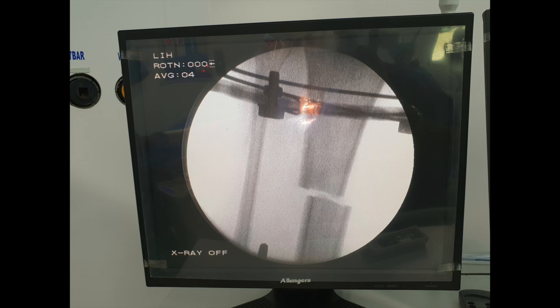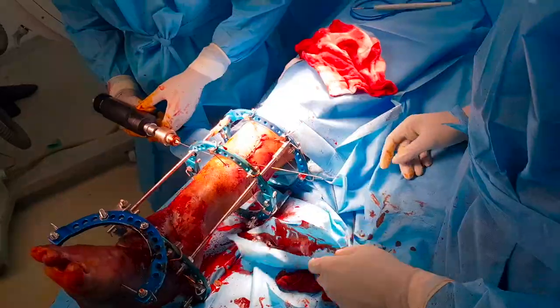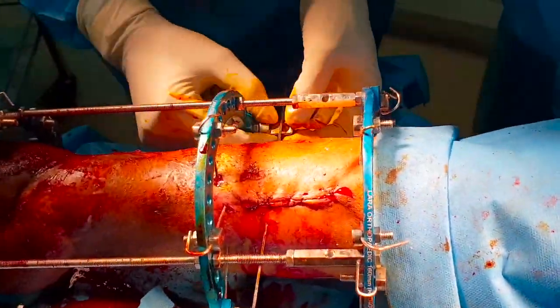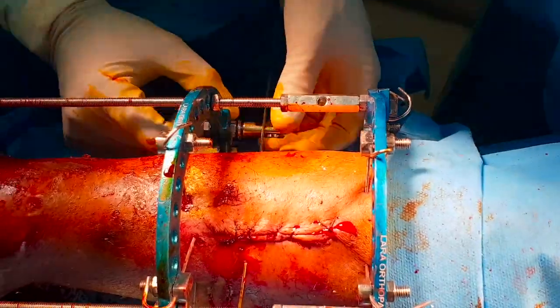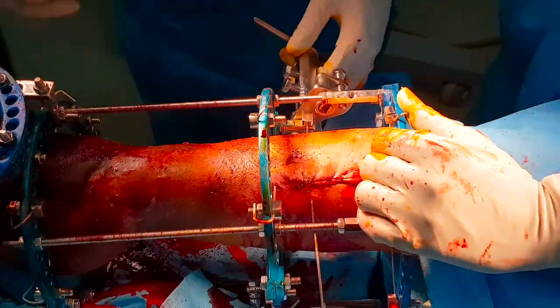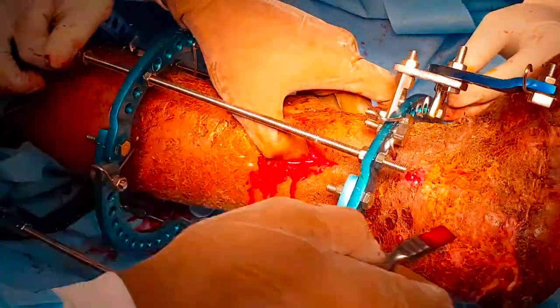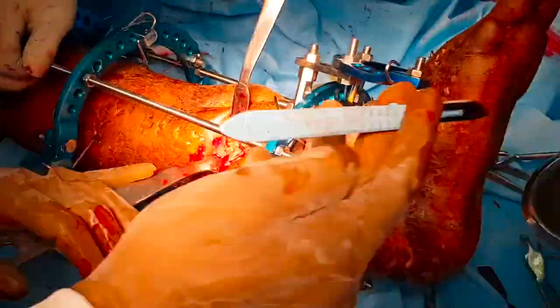After crossing one cortex, the olive wire is pulled from the other side and attached to a post wire fixation bolt assembly. Using a manual tensioner, we now tighten the wire, which makes the olive pull the displaced fragment more centrally to a position of acceptable bone transport and encouraging regenerate formation. The corticotomy site is then closed.